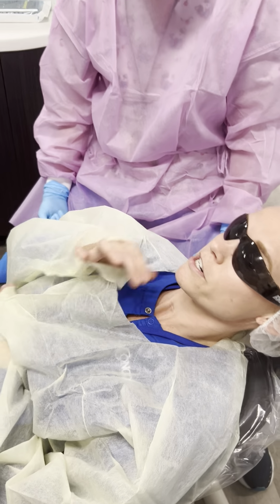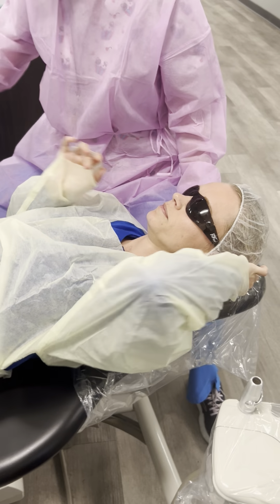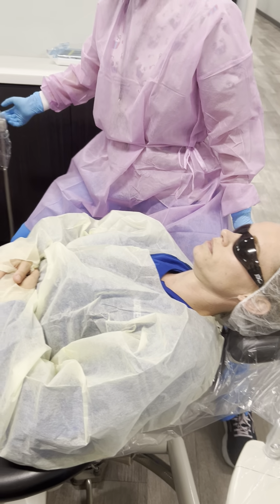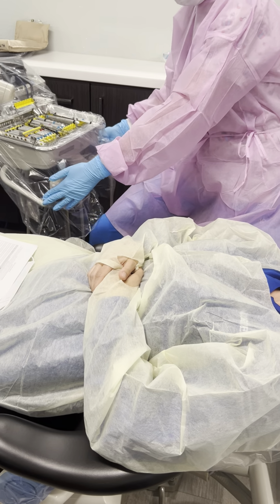We're gonna have something to measure in there. Okay, so you're gonna place your patient in supine position. Always bring your tray close to you, and also always at the level of your waist. There's a button here, right? You're gonna push it down.